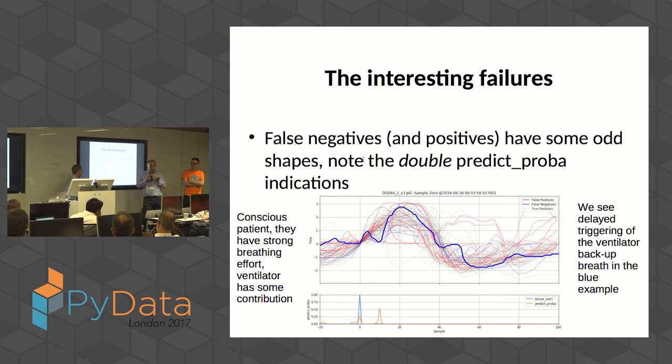The one where the baby is not breathing at all, that's very easy, of course. And the other one, which you just saw, is very, very difficult. Usually in clinical care, we see something in between these two extremes. And I think myself, even in this one, I have an over 90% chance, at least 95, to be very certain where the breath start is.